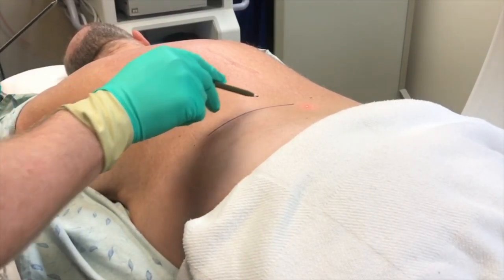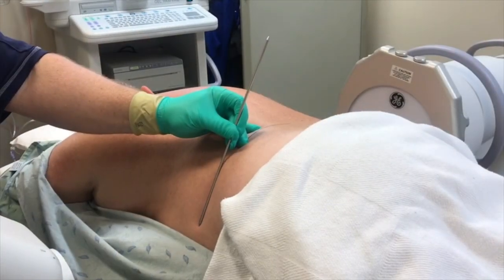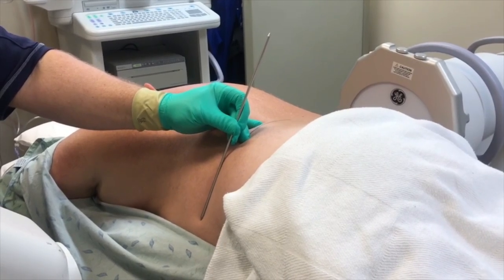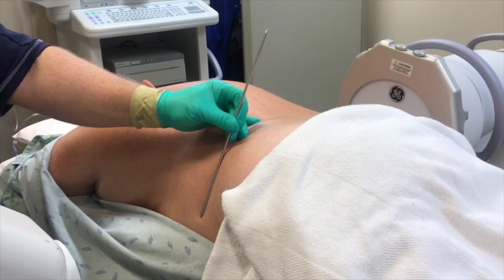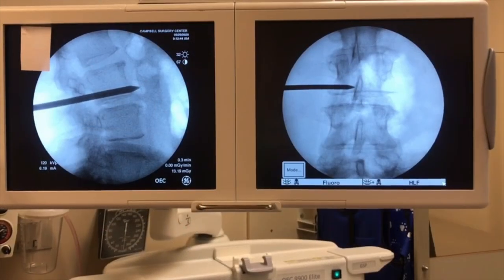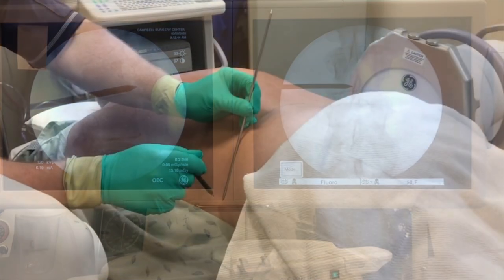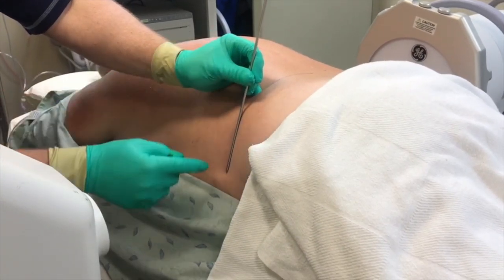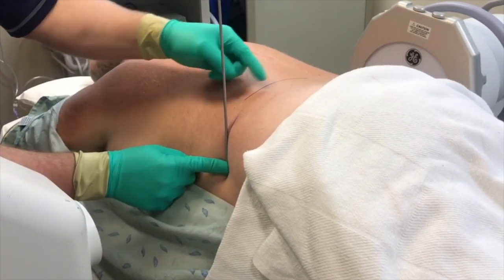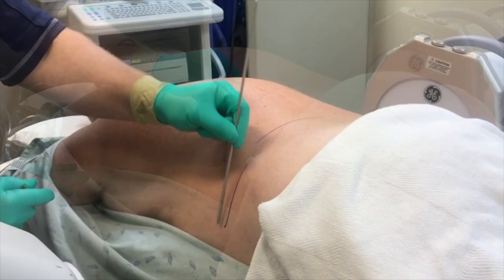Somewhere out here is where we're going to go with our needle, and we're going to stay parallel to that line to target the foramen. We then get a lateral view, place the switching stick to the very front of the disc space parallel to the disc, and under the lateral fluoroscopic shot the switching stick goes all the way to the front. We now have two lines 90 degrees to each other, which we draw on the skin. These two 90-degree lines define a plane that bisects the foramen and targets Kambin's triangle exactly where you want.